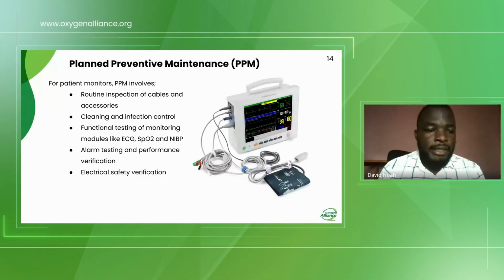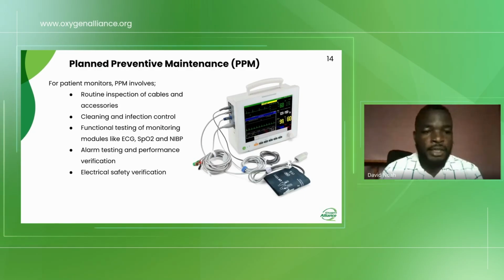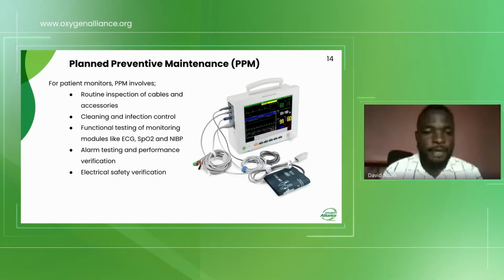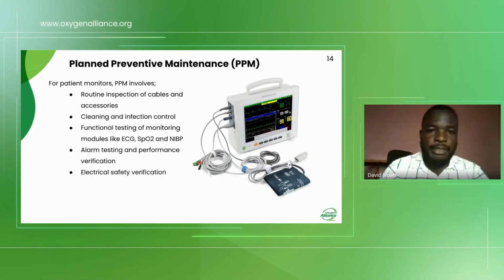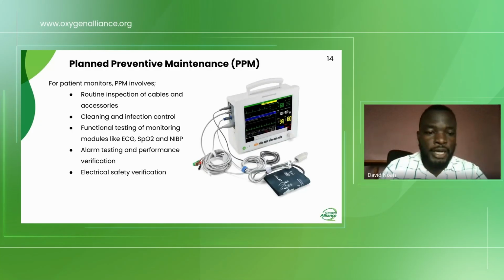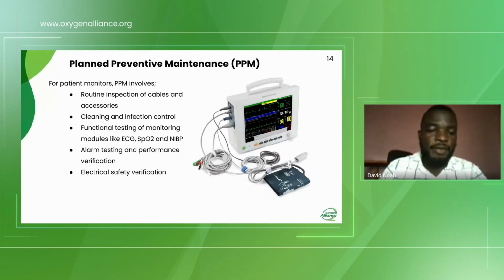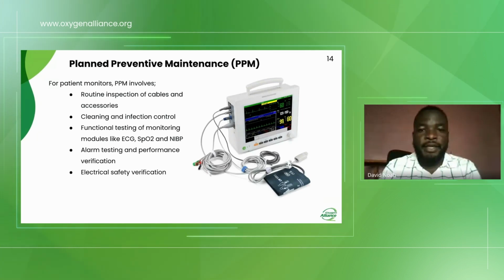In patient monitors, planned preventive maintenance involves routine inspection of cables and accessories, cleaning and infection control, function testing of monitoring modules like the ECG, the SpO2, and the non-invasive blood pressure, alarm testing and performance verification, and last but not least, electrical safety verification.